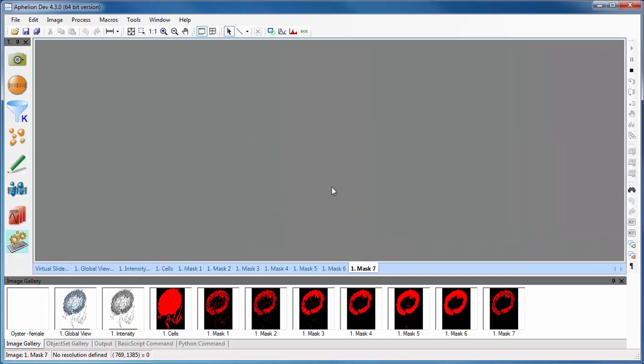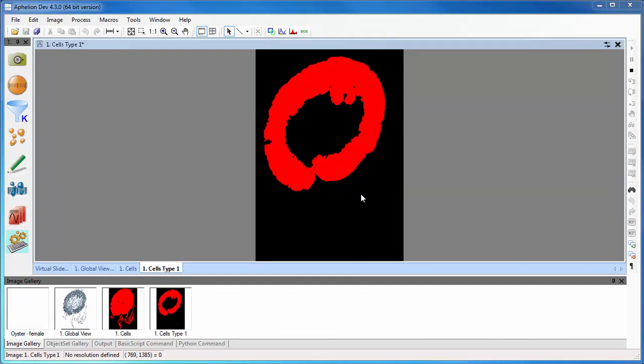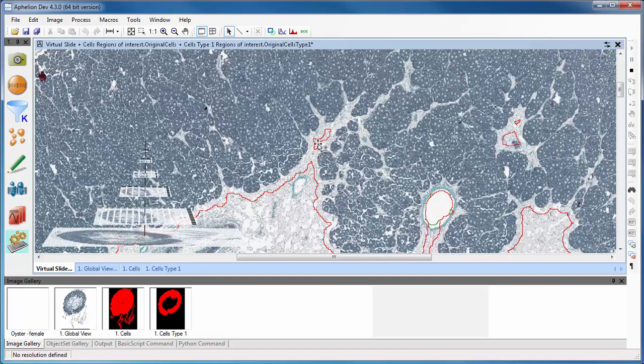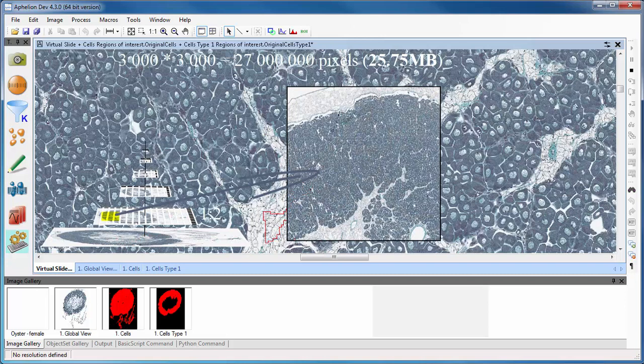The software can then segment the cells of the region of interest and make a preliminary measure of its area. The segmented region or regions can be displayed as overlays on the full image to allow visual verification.